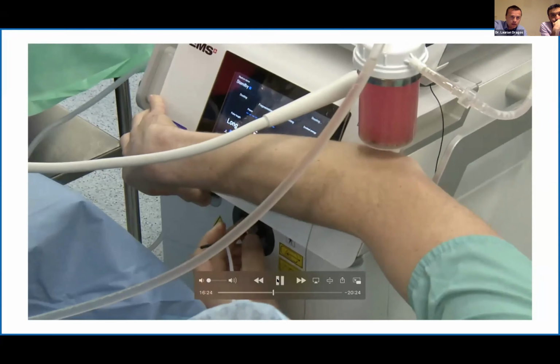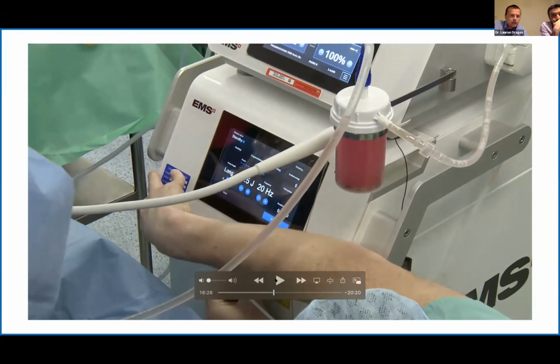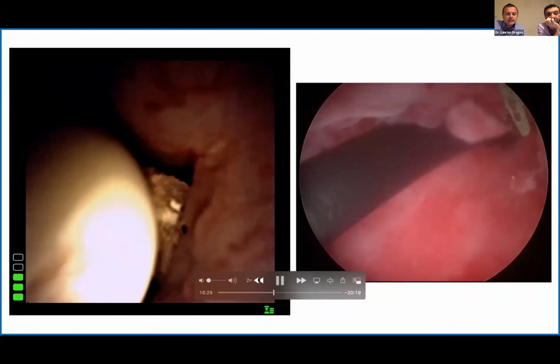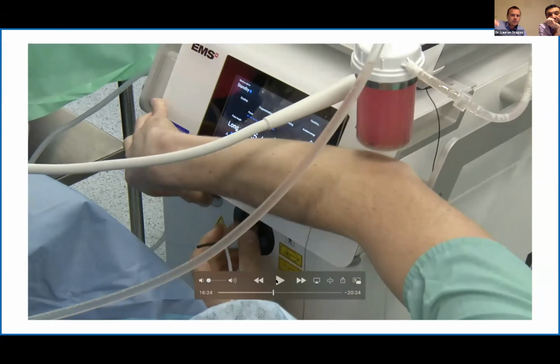However, I don't know if you can clearly see. So this is with attaching the laser fiber. But if you, I'm going to pause the screen here. Basically, what I wanted to tell you is that having the laser machine and the Trilogy, so both lithotripsy devices, on the same stack is quite useful. Yes, same stack is quite useful.